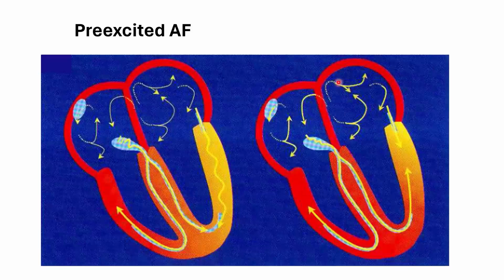In the second, right-hand diagram, the accessory pathway conduction is less while the AV node conduction is more brisk. So the QRS here is more from the AV node, while from the accessory pathway is less. So in a pre-excited AF, you will have the typical irregular, wide QRS rhythm, and you will usually have varying degrees of pre-excitation.